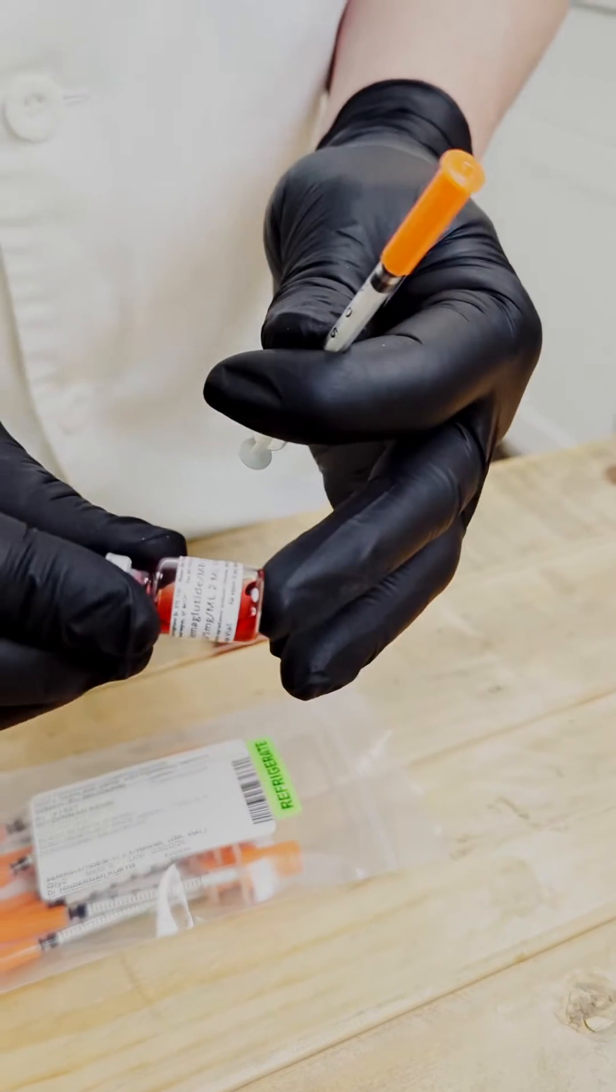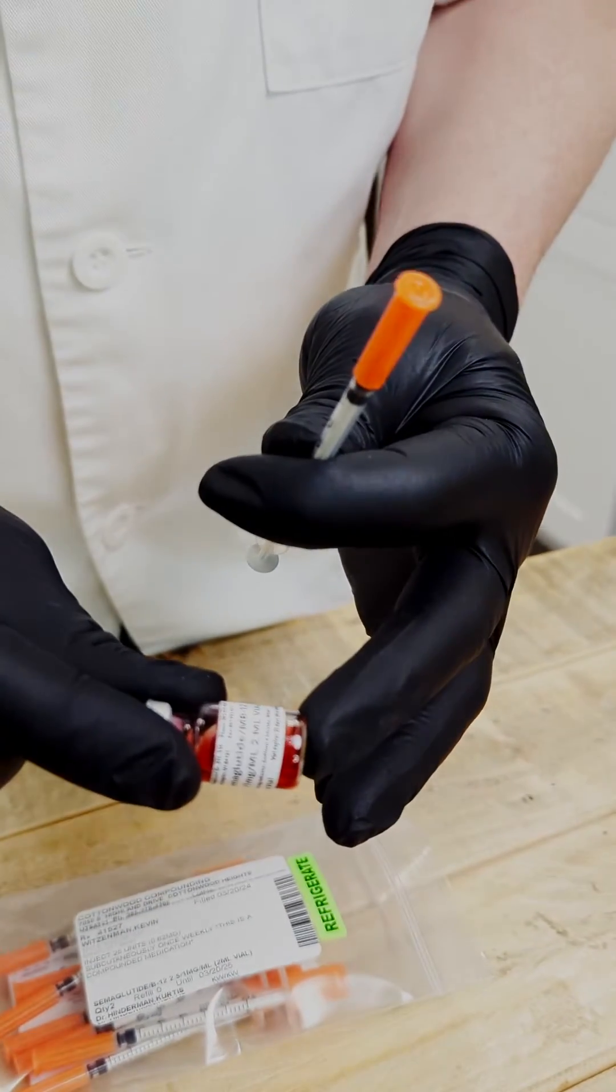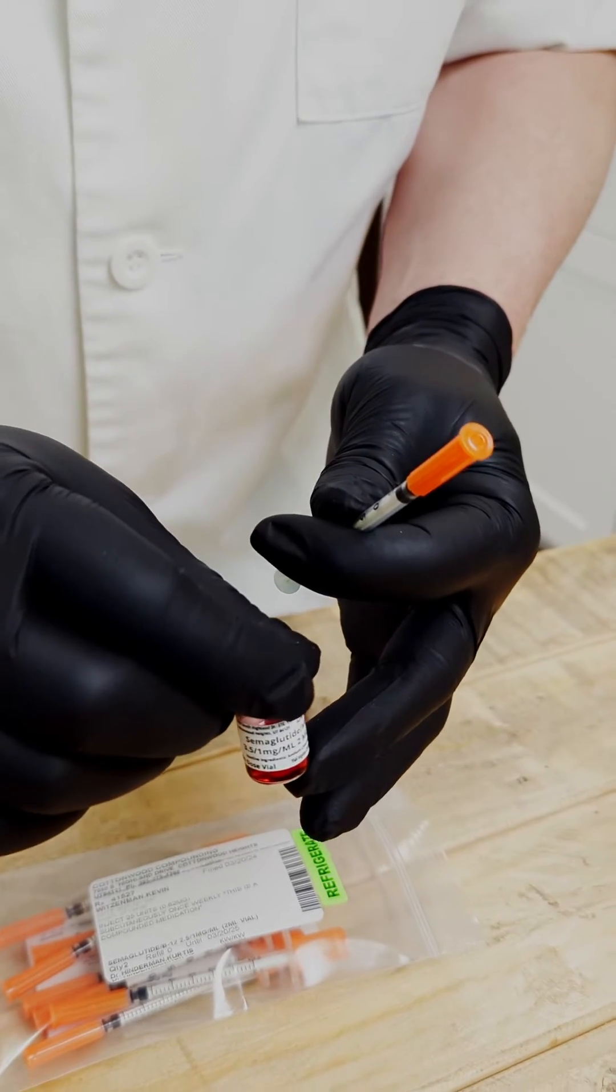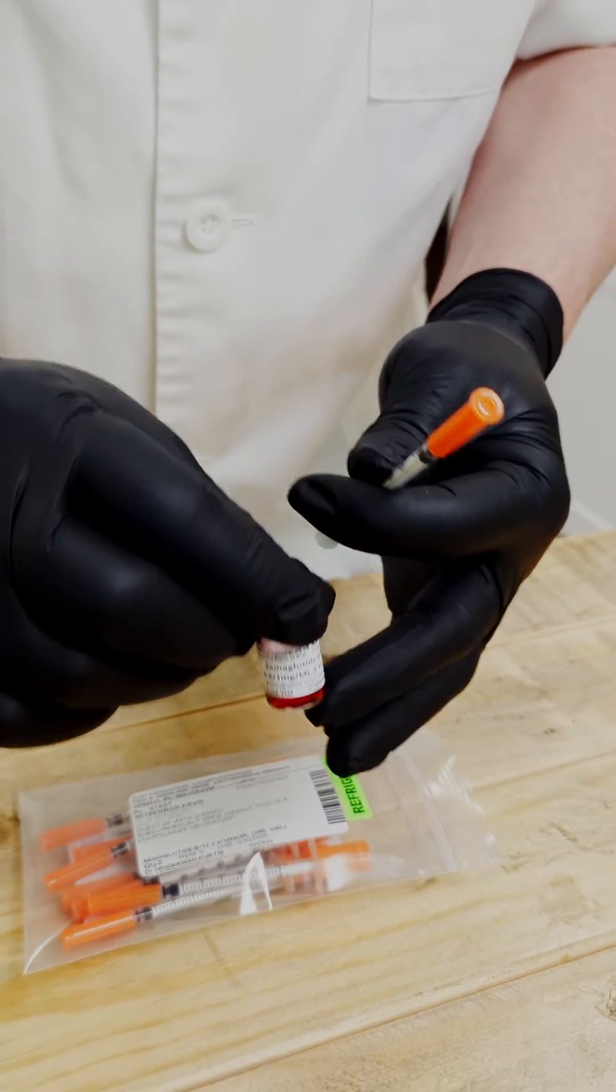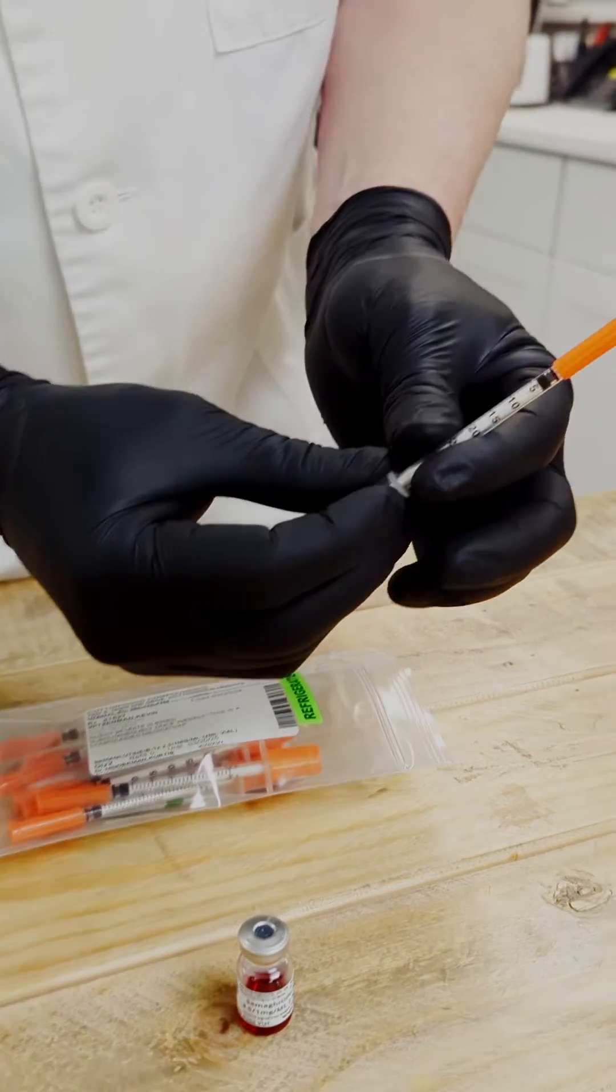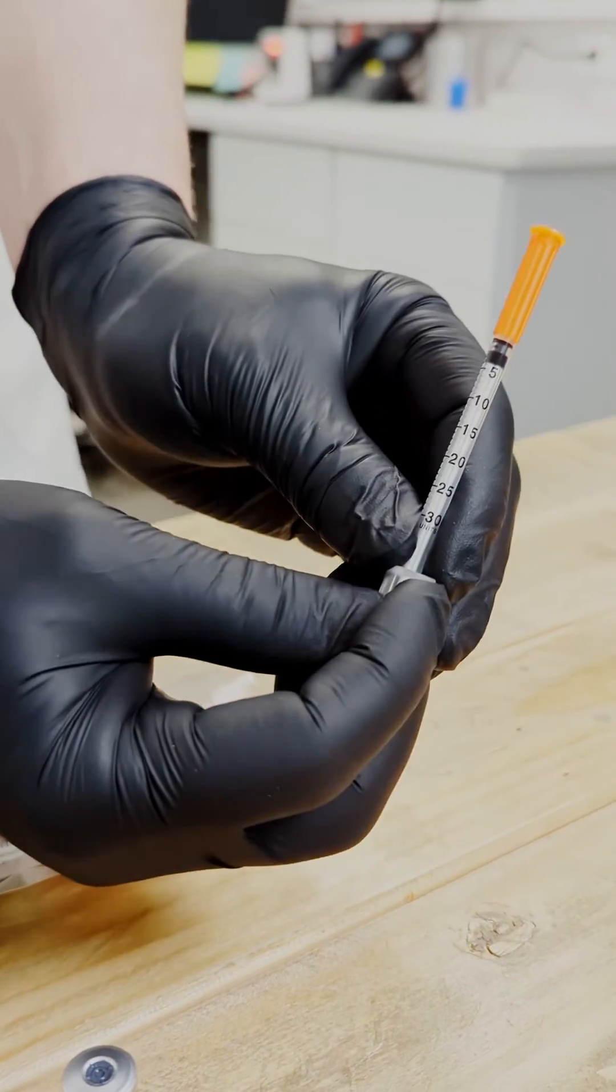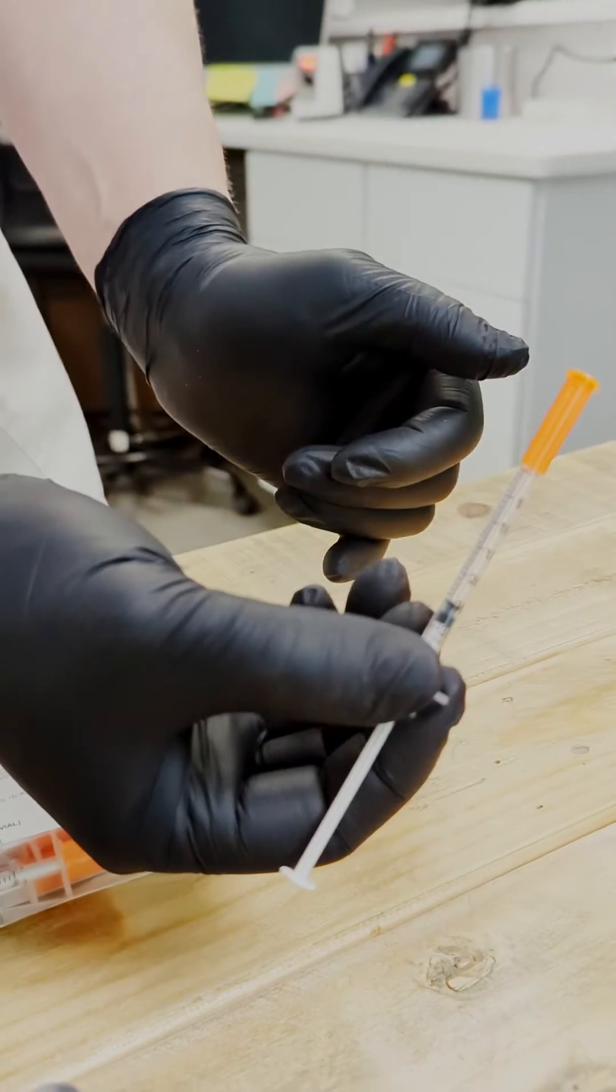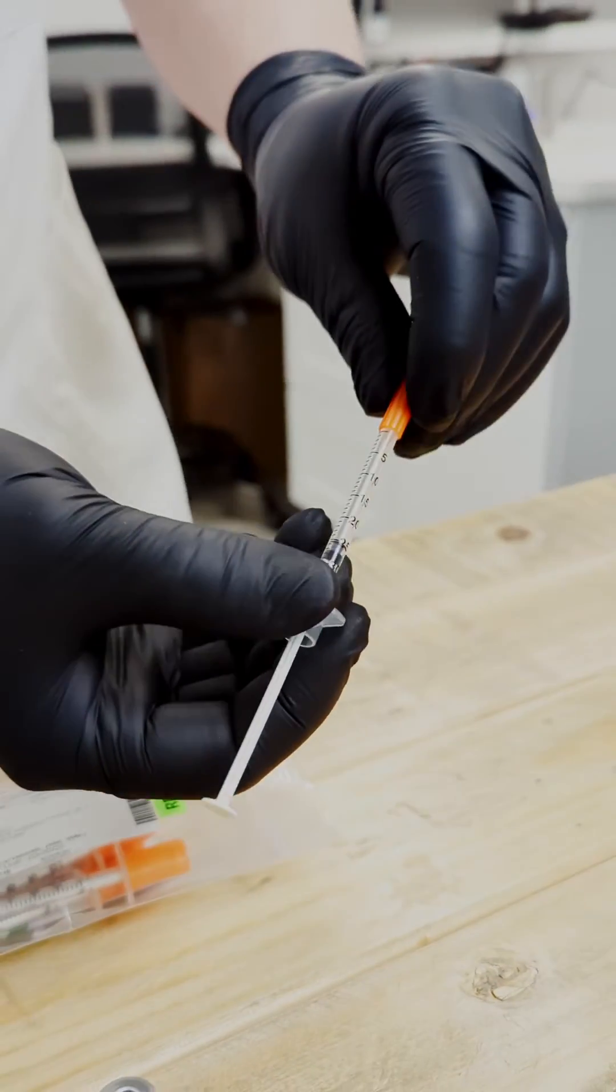If we are pulling 25 units out of this vial, we are going to want to put 25 units in to this vial to create that equilibrium. And we're going to do so by pulling air into the syringe. So we'll pull air up to 25 units. And it's a good double check on your dose as well.